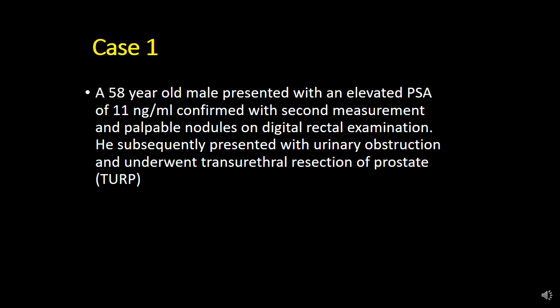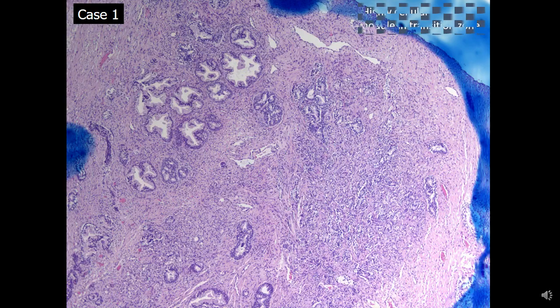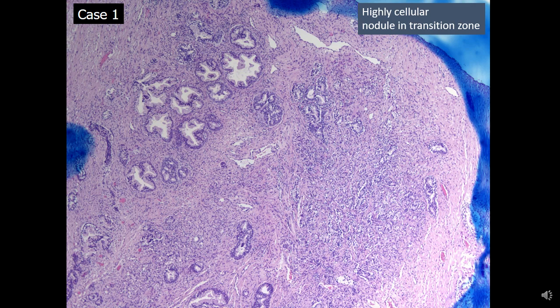This case was from a 58-year-old male who presented with an elevated PSA of 11 nanogram per ml and palpable nodules on digital rectal examination. He subsequently presented with urinary obstruction and underwent transurethral resection of prostate. In this TURP specimen we are seeing multiple cellular nodules.